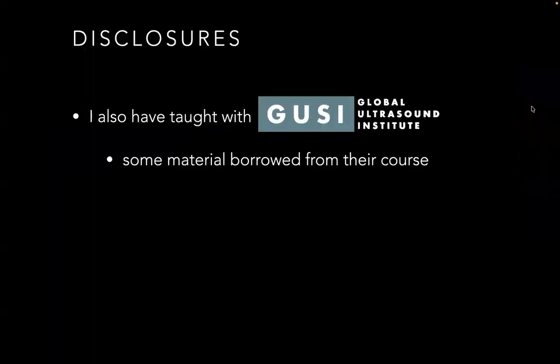Some disclosures are that some of these cases and slides were borrowed from Global Ultrasound Institute. So we'll just start off with a few cases that can really show the value of point-of-care ultrasound at the bedside in the primary care setting.